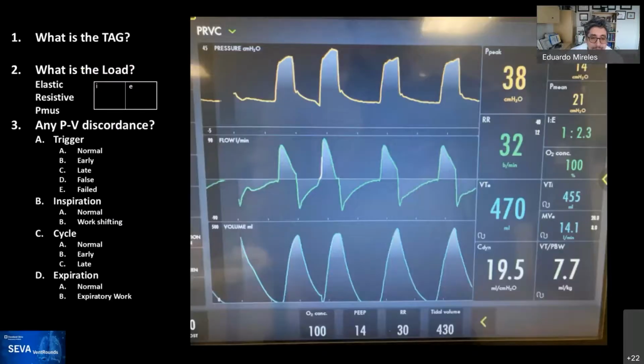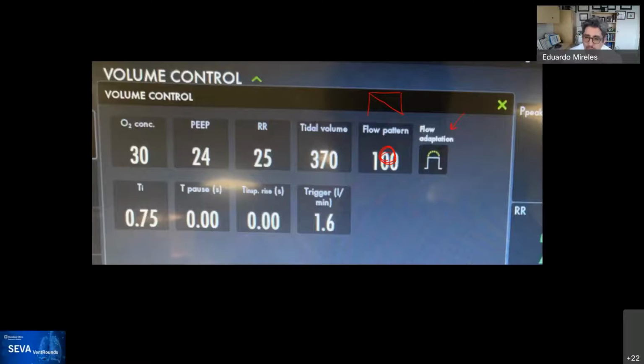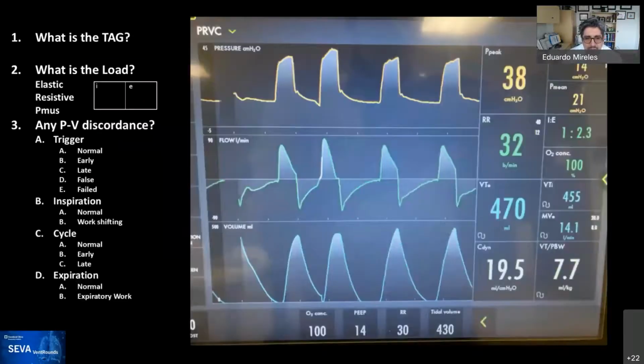Okay. All right, so it's time to switch to another targeting scheme. This will become obvious as we go through it, and I put a couple of examples here, but there are some nuances between ventilators, so remember this doesn't mean that every ventilator has that.